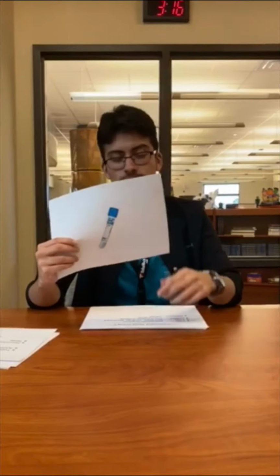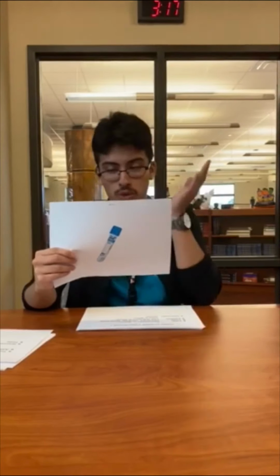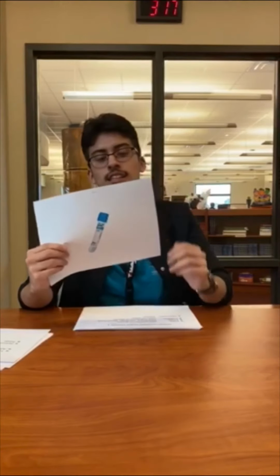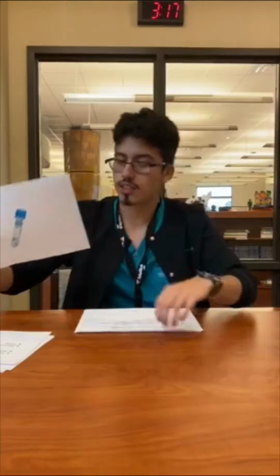Then you have light blue, which is used for coagulation tests or prothrombin time tests. Its additive is sodium citrate, about 3.2% of it, and it's an anticoagulant. Specimen used is double spun plasma. So as you can see, light blue. So it's stop light blue.